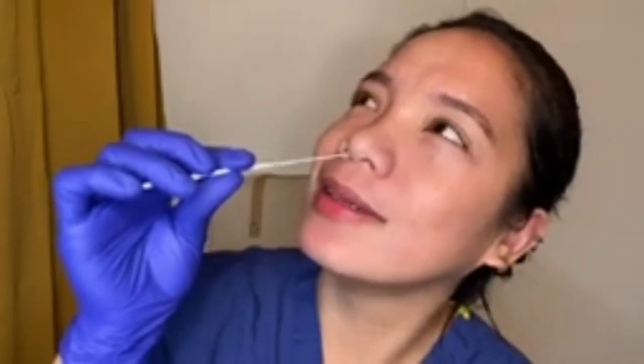Now open the sample swab. I know this doesn't feel pleasant, but here we go. I will gently insert the tip of the swab inside my nose and gently swirl it at least 10 times on each side of the nose. 6, 7, 8, 9, 10 — and then the other side.